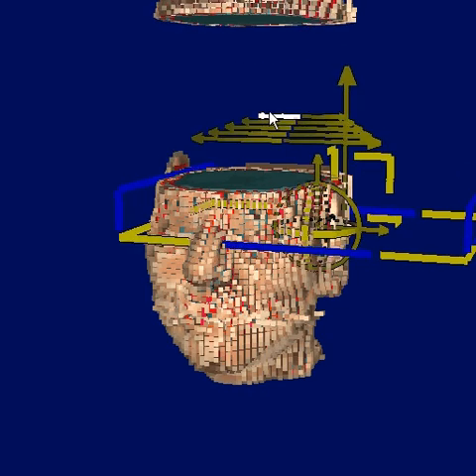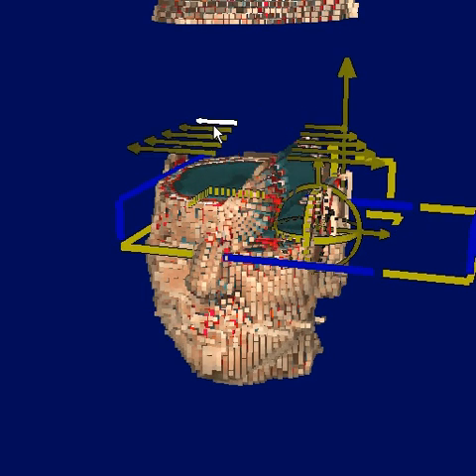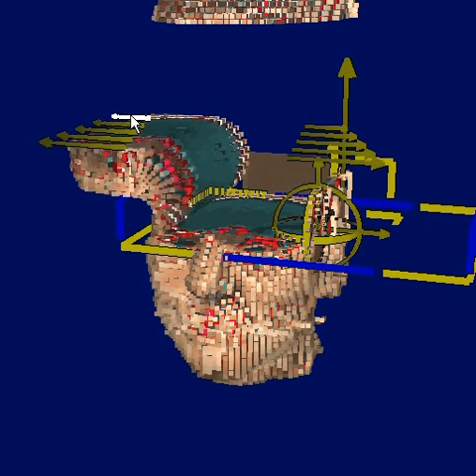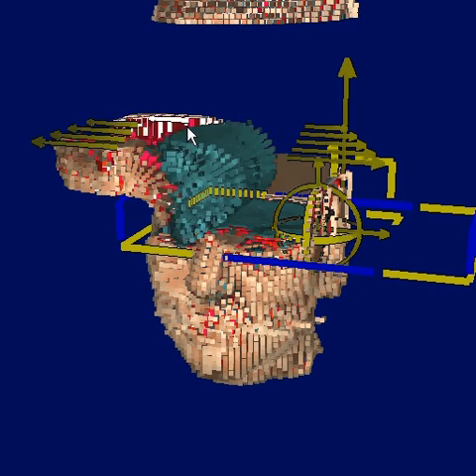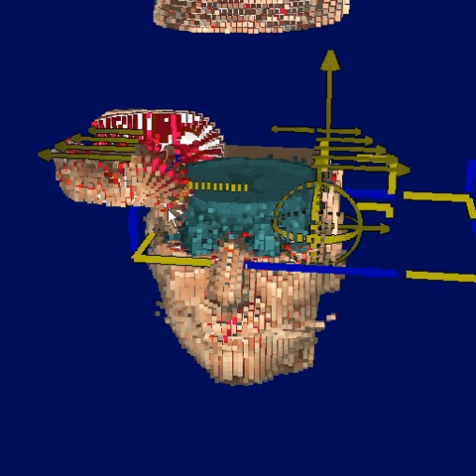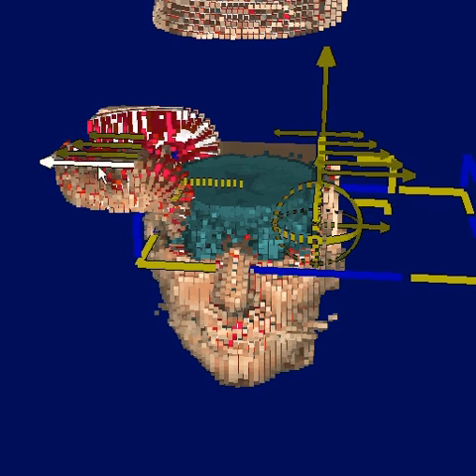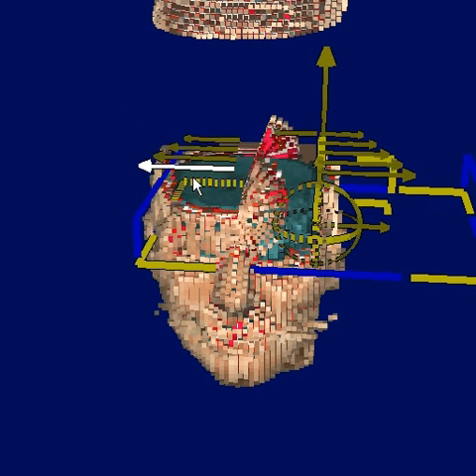We see a series of arrows. Each one is attached to a different layer. I can grab the innermost layer and peel it open, and we see all the other layers follow with it. If I put the innermost layer back, the other layers stay where they were. If I grab the outermost layer and peel it back, the other layers follow.